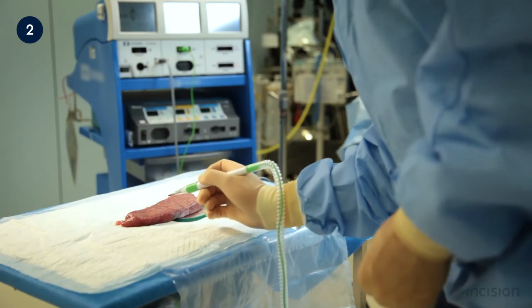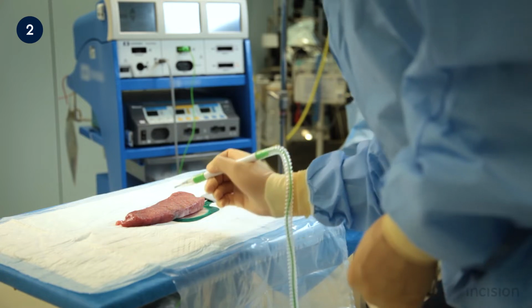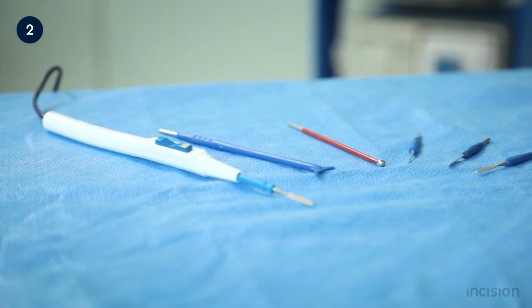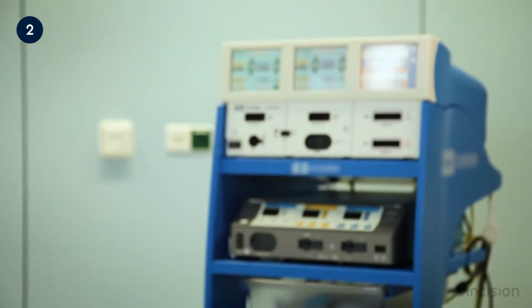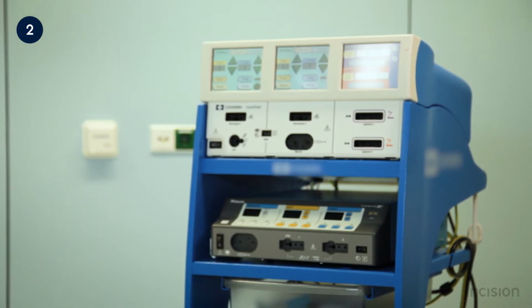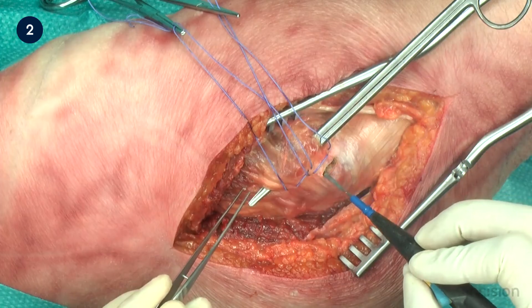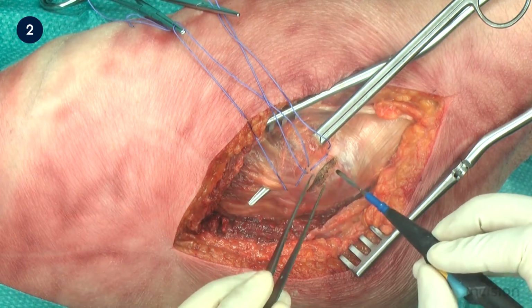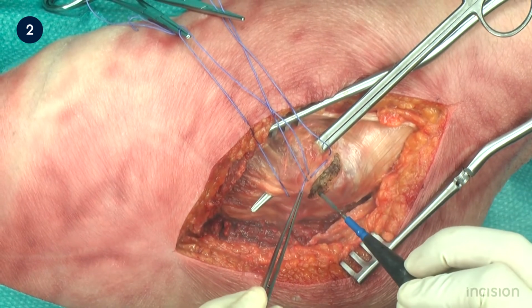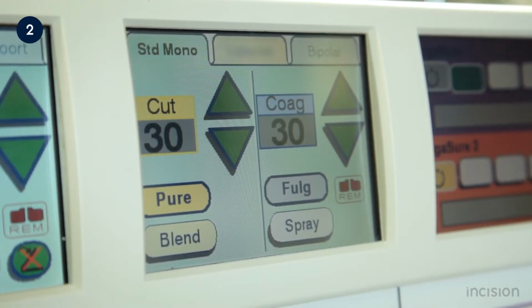In addition, the power required for a certain effect varies between different tissues due to differences in electrical resistance. It is also influenced by the type of electrodes and electrosurgical unit used. There are different methods for controlling the output of the generators in electrosurgical units. In these automatic control methods, changes are constantly made to the voltage and current depending on the measured electrical resistance of the patient's body and maximum power settings of the device.